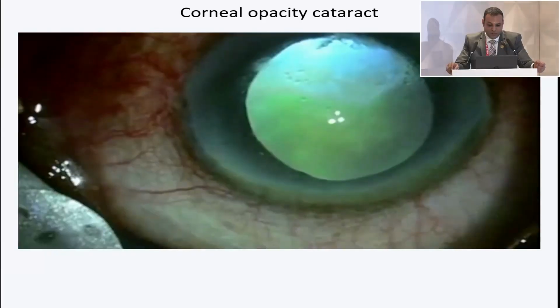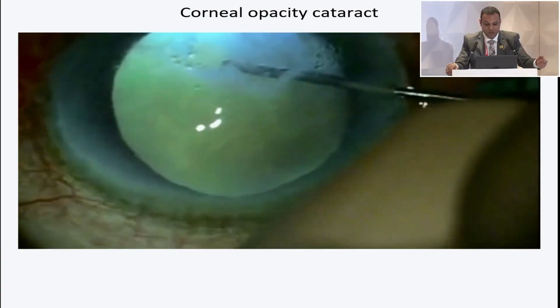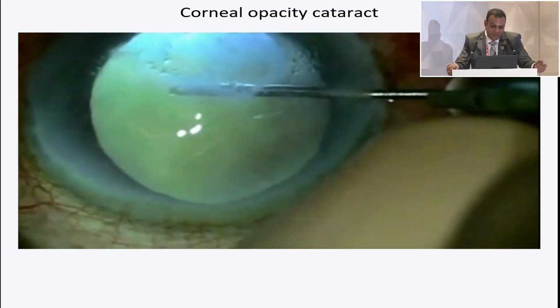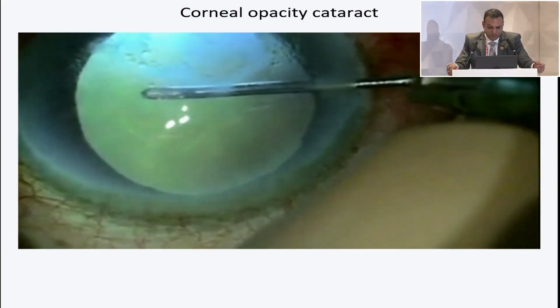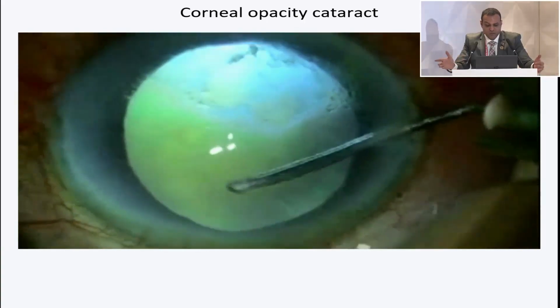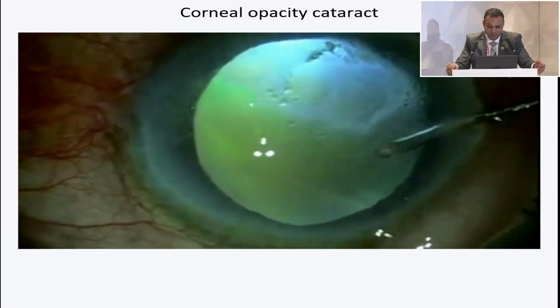So again, putting in a chandelier illumination, you can see how nicely you can visualize your rhexis at any particular point of time. You can switch on and switch off between your microscope and your illumination.